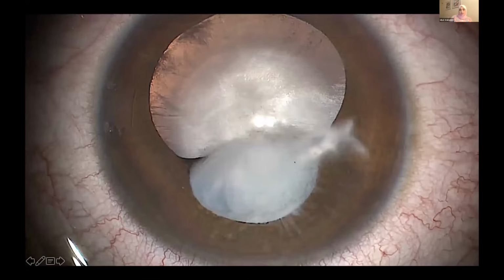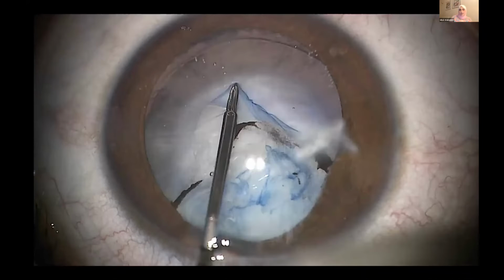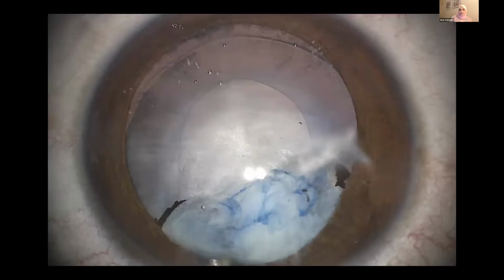But sometimes we have a peripheral defect in the anterior capsule where we cannot see the peripheral edge of the defect. In these cases, we make a half anterior rhexis. We cut the edge of the anterior capsule, and then with the rhexis forceps, we make a half anterior rhexis. And here, after irrigation aspiration, we continue in the conventional way, and we can even implant the IOL inside the capsular bag.